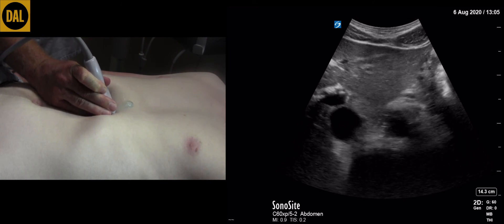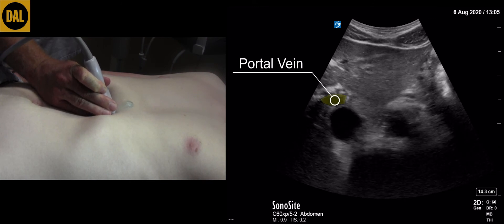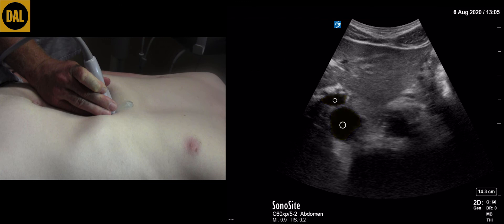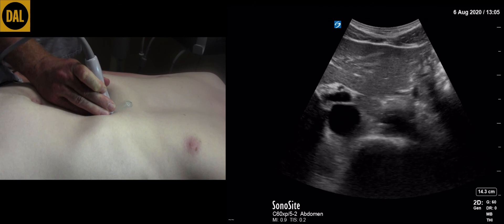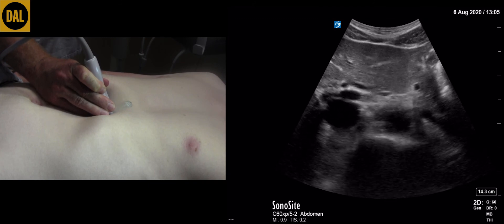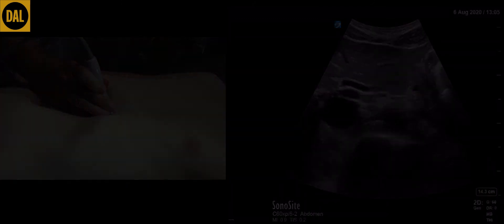In the view displayed here, the portal vein can be seen sitting just anterior to the IVC. This completes the scan of the inferior vena cava.